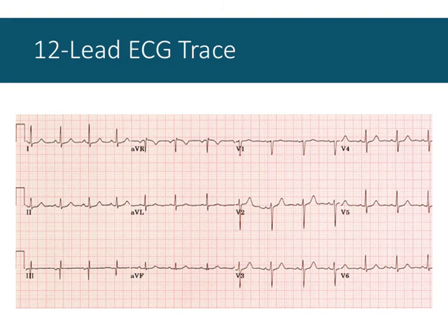You'll notice not everything looks identical, but they share some similar characteristics. You can tell where the QRS complex is, for instance. It's not hidden in any lead. It certainly looks different. It projects maybe more to the downside in some leads than others, but that tells us about the direction of the electrical activity through that lead. We get information about how the heart is working from that information.